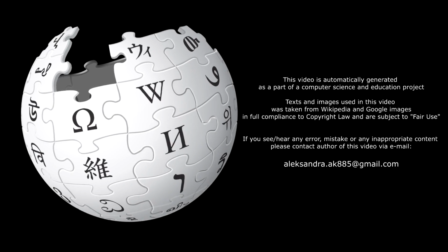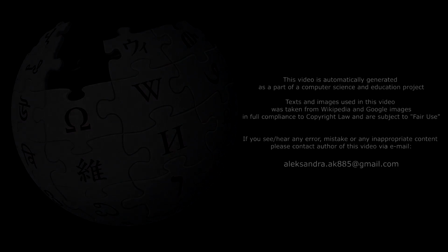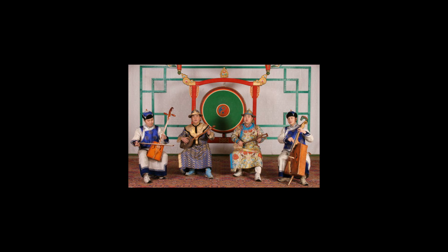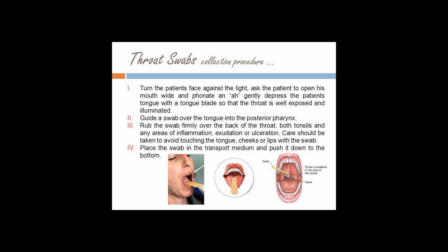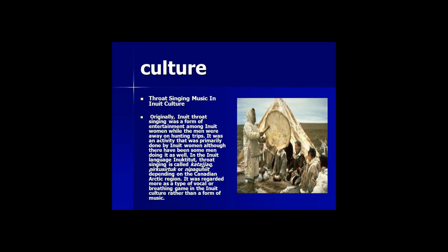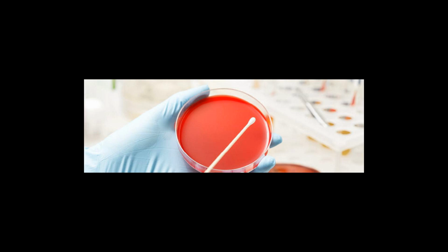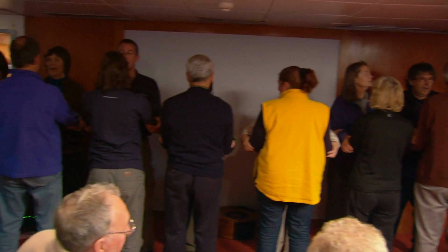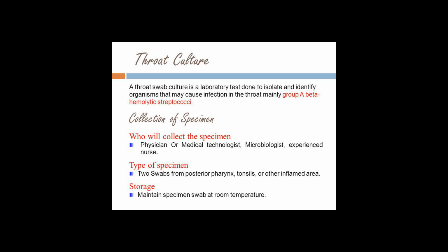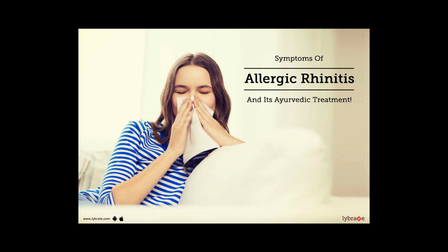A throat culture is a laboratory diagnostic test that evaluates for the presence of a bacterial or fungal infection in the throat. A sample from the throat is collected by swabbing the throat and placing the sample into a special cup culture that allows infections to grow. If an organism grows, the culture is positive and the presence of an infection is confirmed. The type of infection is found using a microscope, chemical tests, or both. If no infection grows, the culture is negative.